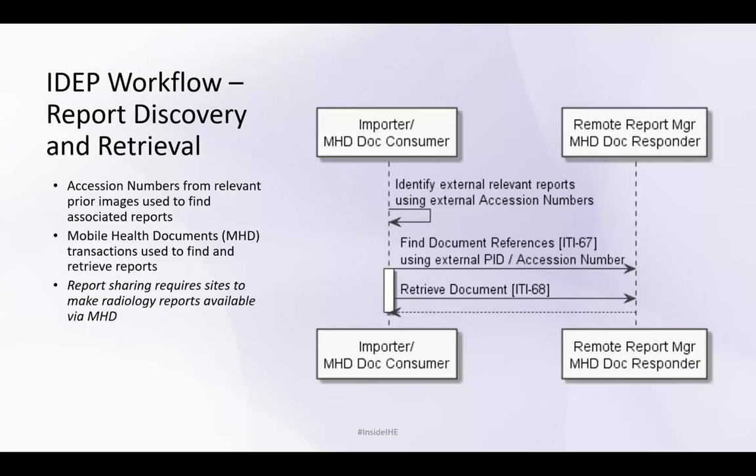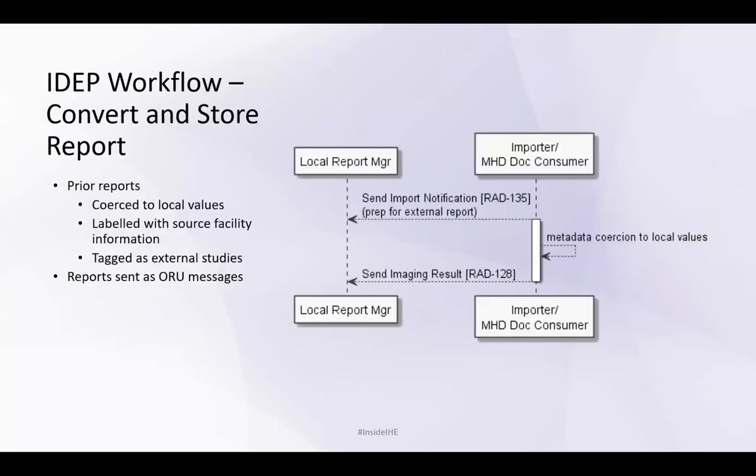And the report formats are specifically using text and PDF radiology reports only. So we try to narrow the scope of the reporting to make it as easy to support as possible. And similarly, reports go through a localization and conversion step.